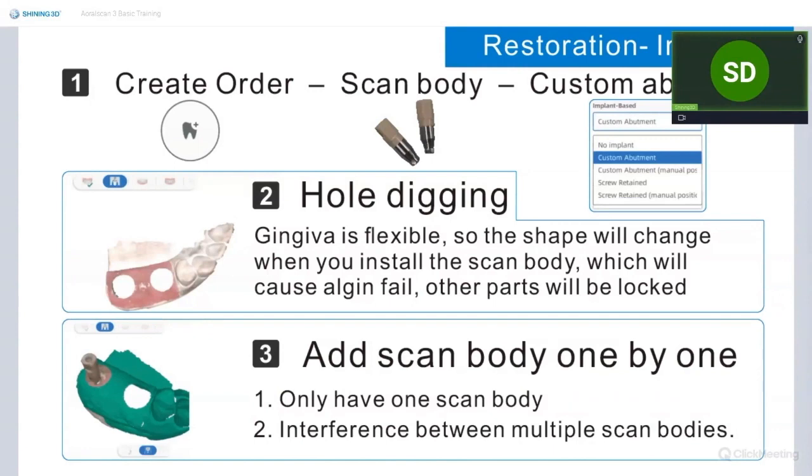Our OS does not scan or pick up the models as fast as yours does. So we do not have something like the rapid scan. What I did is just the same as you guys. It's a normal scan. I think it's more related to your PC configuration.